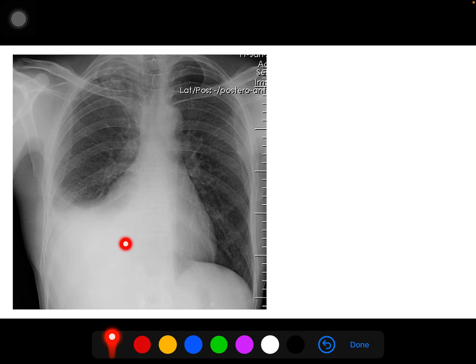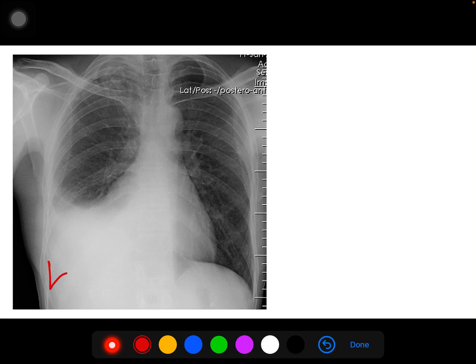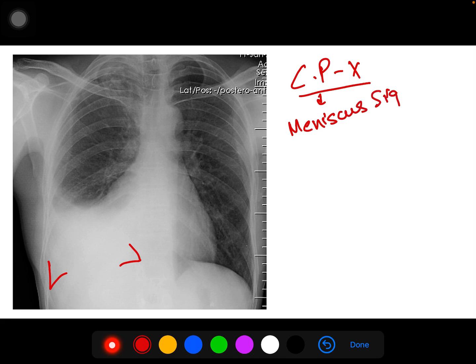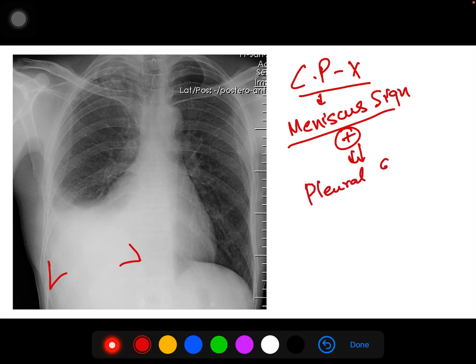In the first image, you can't see the costophrenic angle, you can't see the cardiophrenic angle — it's all white. But you can see the bronchioles here, so there is presence of lung at least here. Over here it's all normal — you can see the costophrenic angle. So when you can't see the costophrenic or cardiophrenic angle, this is called the meniscus sign, and when meniscus sign is positive it is highly suggestive of pleural effusion.